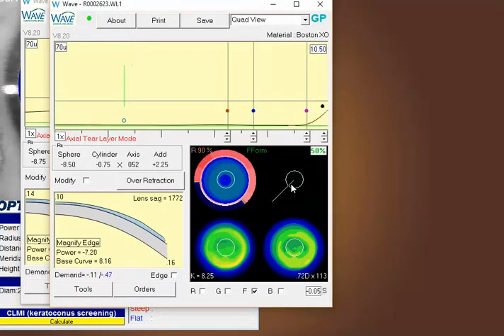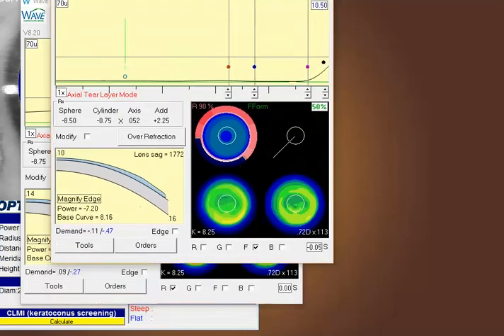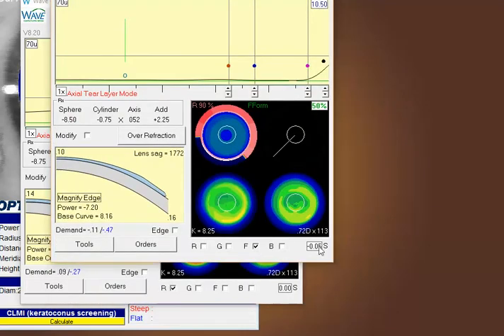Basically what I did was I switched over to freeform, and I also put a little asphericity to it. And by doing that, when I clicked over and designed the lens, you immediately see how that contact lens line matches the cornea very nicely. So you've got a much more tightly fitting lens on this eye. You can also adjust it a little bit more if you need to.